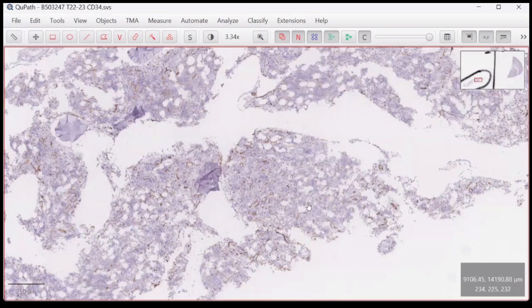Because in a hypocellular marrow with very few blast cells, they are still able to form clusters that indicate incomplete depletion. But when you have a brisk population of TDT, like in this case, and only occasional one or two clusters while the rest are individual cells, then we lean towards hematogones.